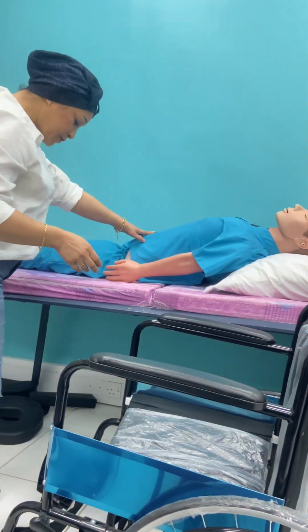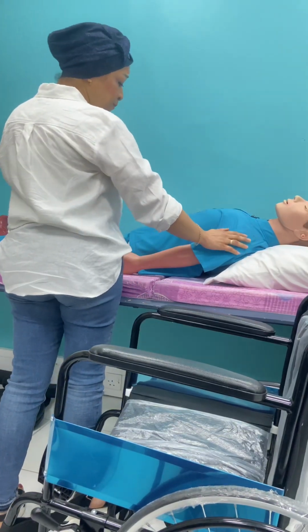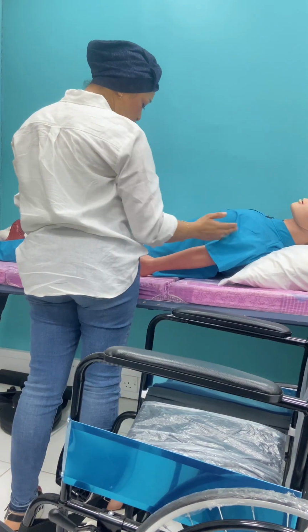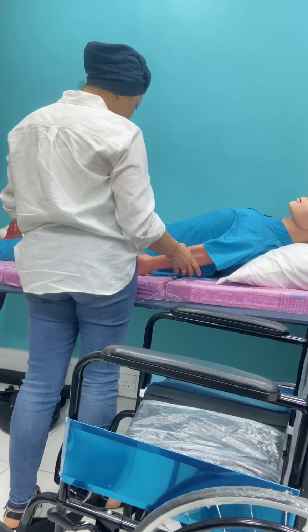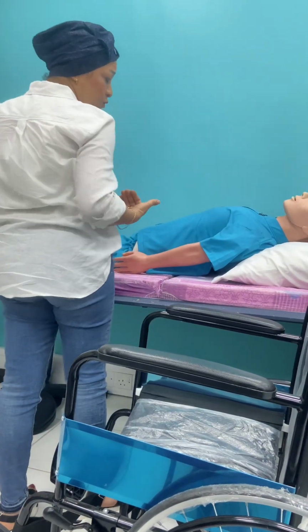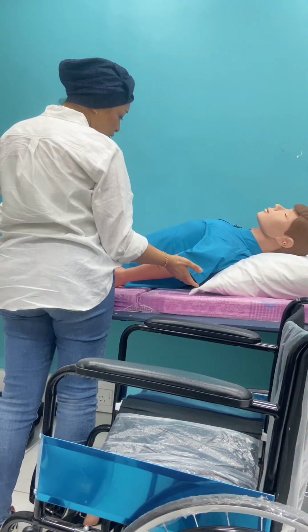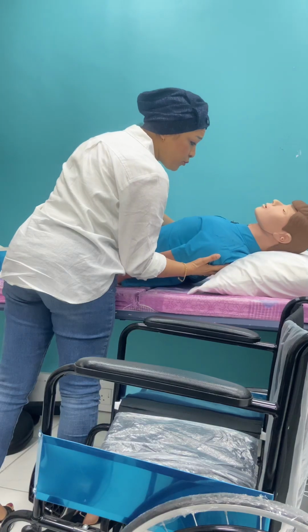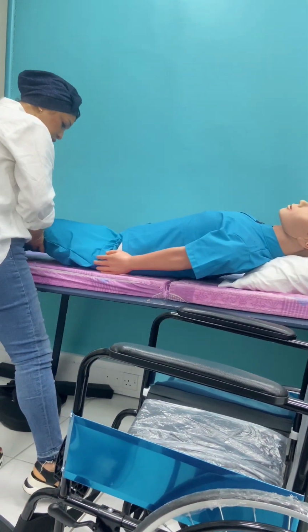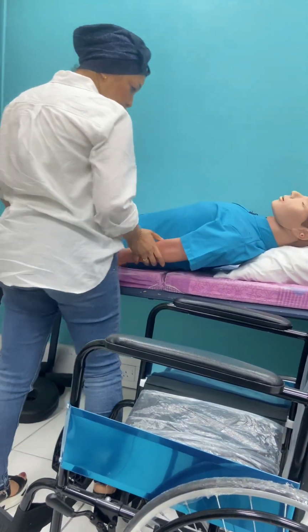I have always to explain to the patient what I'm going to do so that he doesn't get scared and he anticipates the steps. First thing, I ask the patient to come closer to the edge of the bed because he's a bit far away from me and it's strenuous for my back to bend. So I want him to come over. If he cannot, I have to help him, obviously. So I bring him to the edge of the bed in 2 steps, the top part and then the lower part.